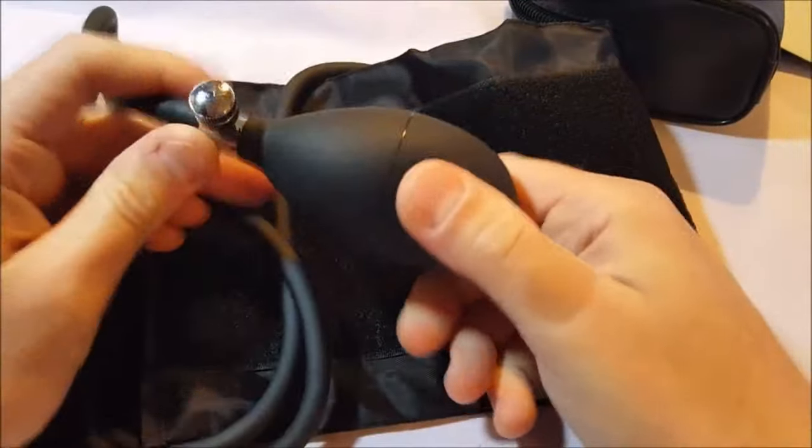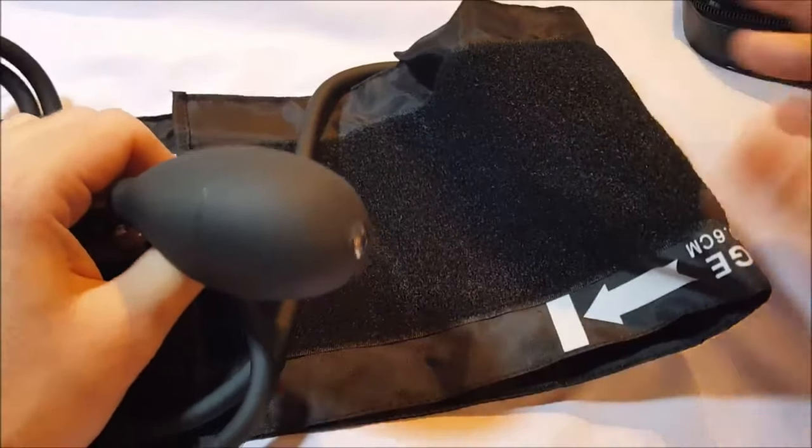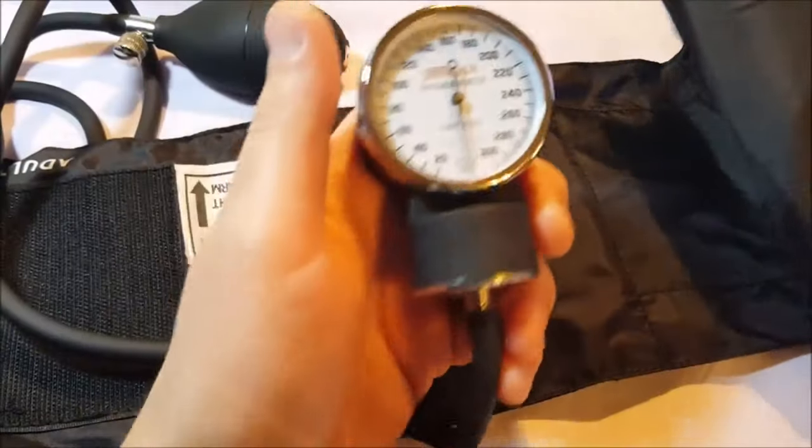There's the cuff. Here's our bulb here with our release. My wife's a nurse — she knows all about this stuff and has one or two of these floating around. So we're going to have to test it and we'll check out the accuracy on it.